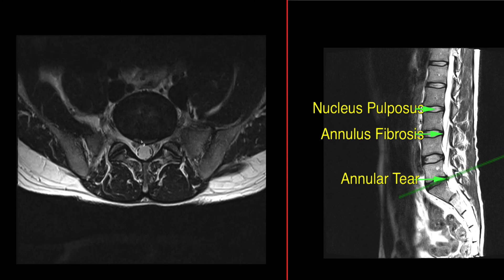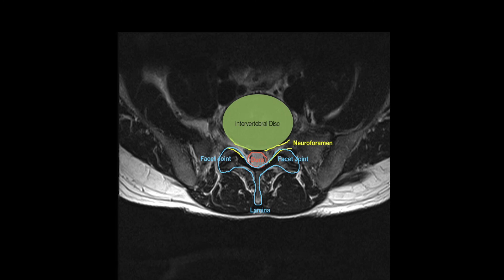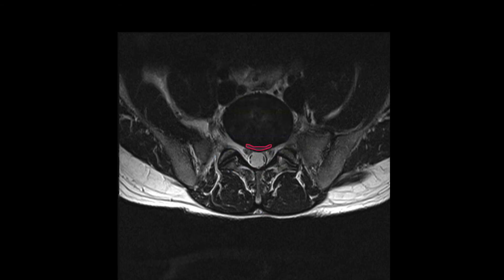I'm going to switch now to a different scene where I've animated the actual annular tear itself. On this axial image, I've labeled the intervertebral disc here in green. I'm going to draw an outline around the lamina and label that the lamina, and then the facet joint on the patient's right and the facet joint on the patient's left. In the center is the dural sac. Inside the dural sac are the nerve roots. On either side are the neuroforamen, outlined in yellow and labeled appropriately. Then we're going to remove all of these labels and identify the annular tear here in the back of the disc and label that the annular tear.